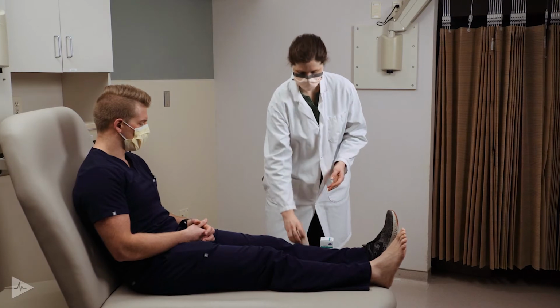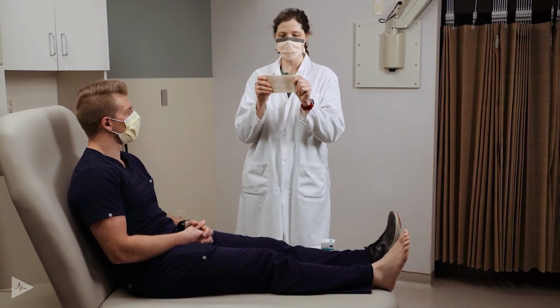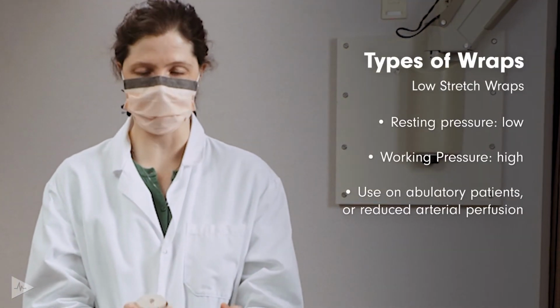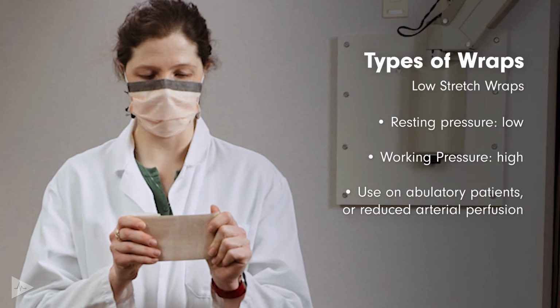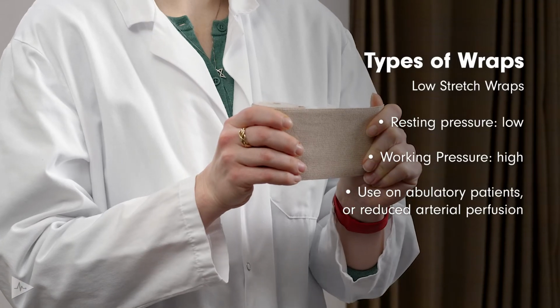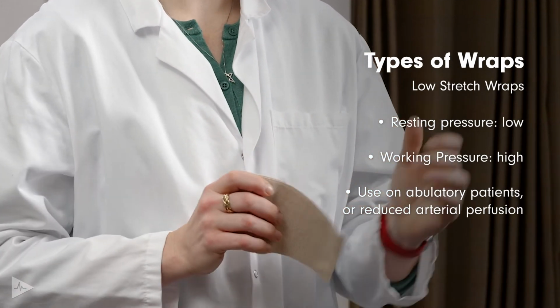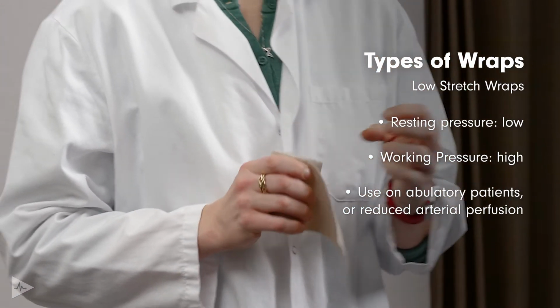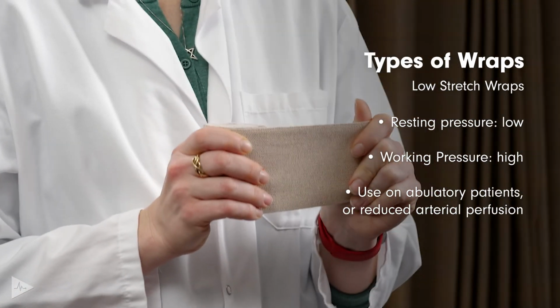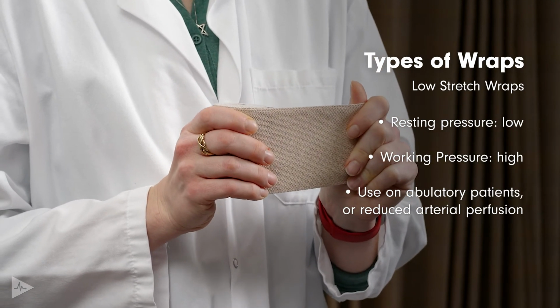The difference then is the low stretch wrap, where we're not getting as much elasticity to the wrap. And so when we apply this, the pressure when the patient is not active is low, as we don't have a whole lot of compression, a whole lot of stretch to this wrap. As they are moving around, we have a stiff exterior compression wrap, and that internal calf contraction will then increase the working pressure and make the pressure high when they are ambulatory. So we will use this on patients that are remaining active.